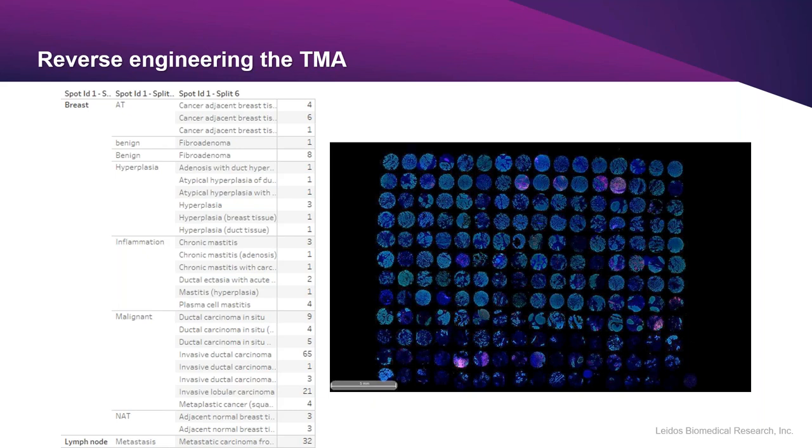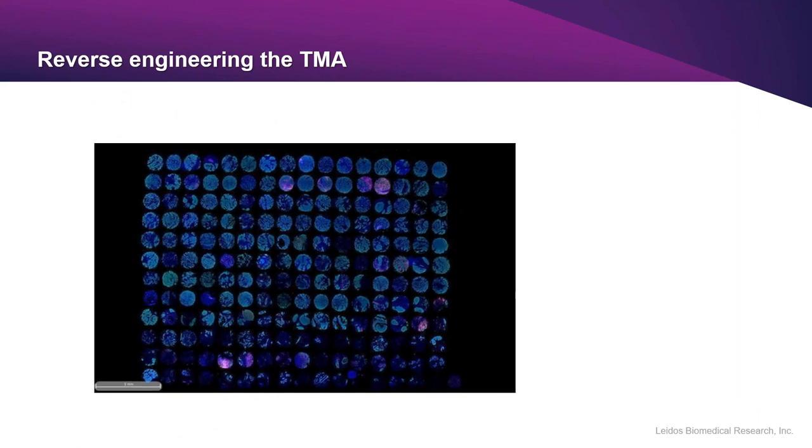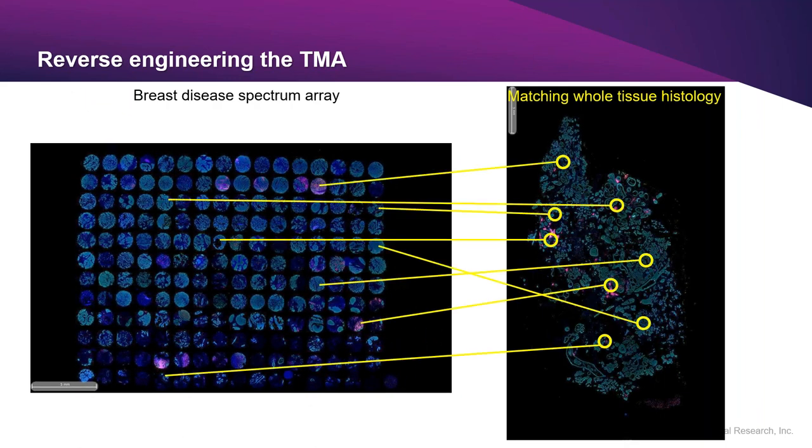One way we examine how much coverage we need to properly estimate the TME 8-plex assay in TMA cores is by trying to recreate the TMA cores in a whole tissue scan. In this manner, we will directly compare the restricted coverage from TMA cores to whole tissue data. We will also be comparing actual TMA cores with the same histological subtype as the whole tissue slide. This combined approach should provide a more complete picture and answer, firstly, how much tissue coverage is needed to properly estimate biomarker response from different analytical targets and tissue histologies, and secondarily, how many TMA cores do we need?